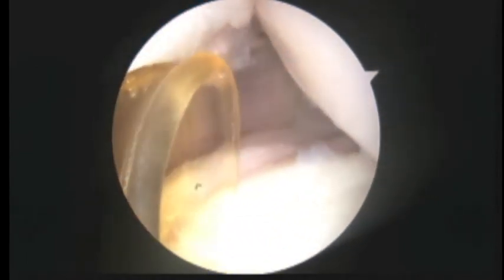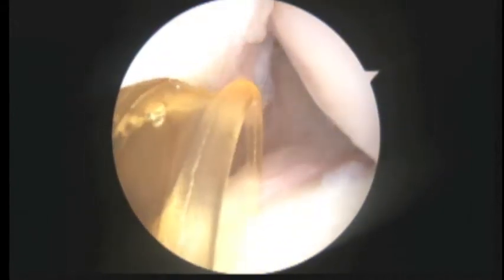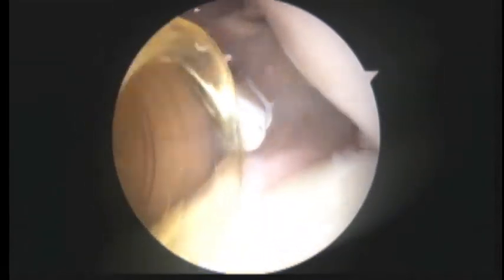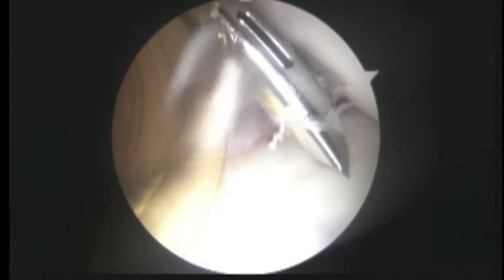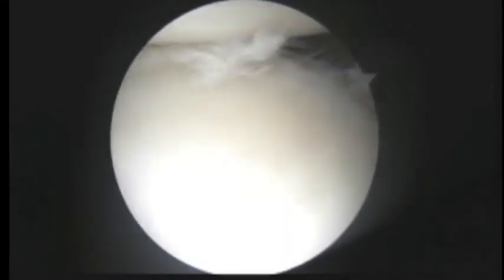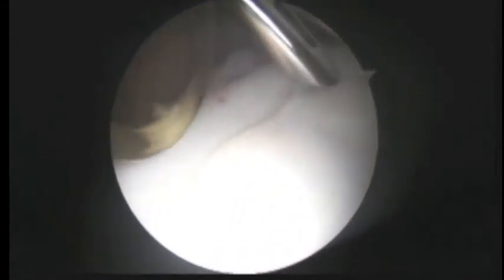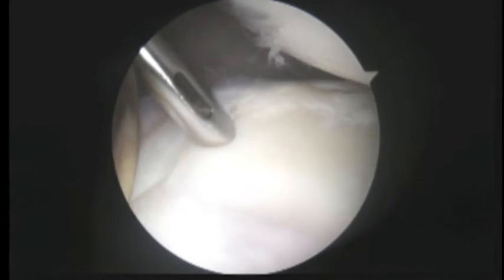We're able to see the point there, and that brings our drill guide right down where we want it here. There's the anterior glenoid, and we can see where 6 o'clock is here. So we're going to place our first anchor in right about here.